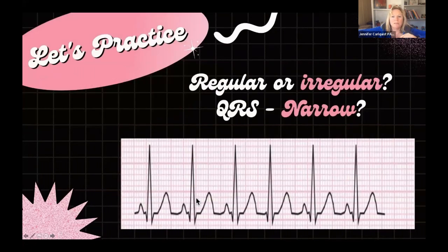Okay, now this one is another fun one for you. This is a really tricky one. So our intermediate folks, this is going to be a good one for you, but I'm going to walk you guys through this. Okay, so the key is looking at this. This one's subtle. It's not regular, because there's a little bit of variation, and the variation happens right here. This one looks the same, this one looks the same, this one looks the same, this one looks the same, but this one's short. So what's going on here that is actually the problem?